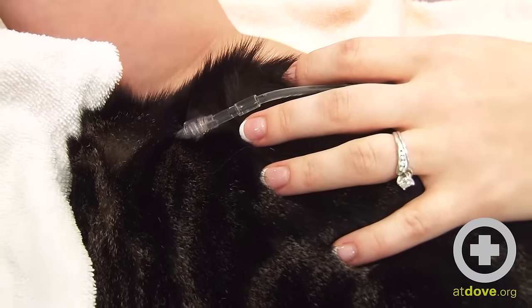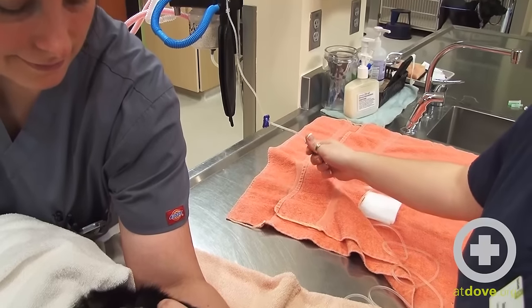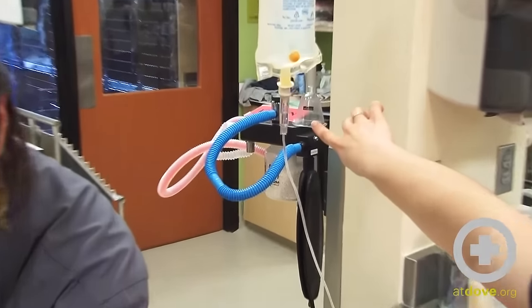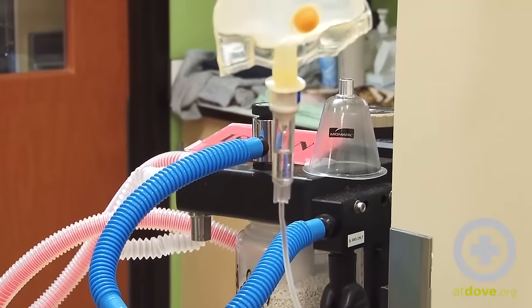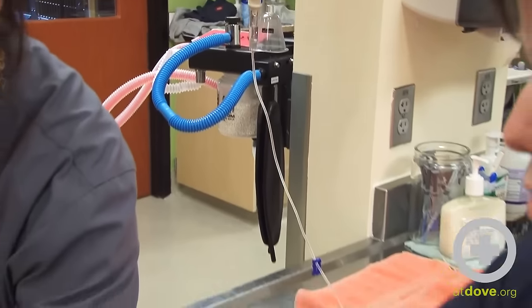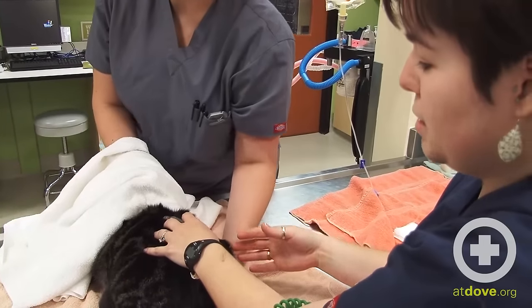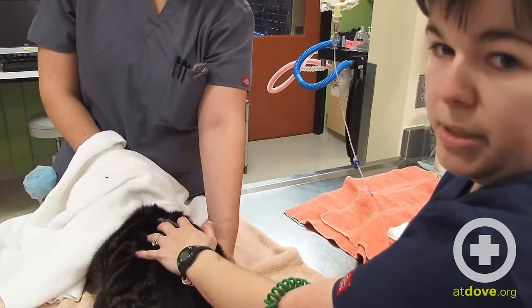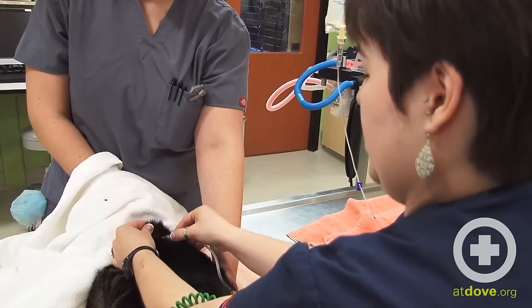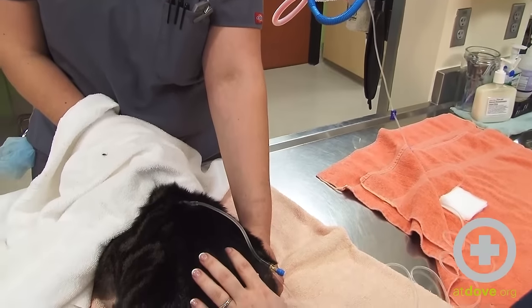I then unclamp the fluid line and you should be able to start seeing the fluids dripping in the chamber of the fluid line. If you see fluid dripping out around your needle or around the skin, it can mean that you have poked completely through to the other side of the skin, which just means you need to reposition your needle. Sometimes you can also position your needle a little bit better in the skin so that the line flows a little bit easier.